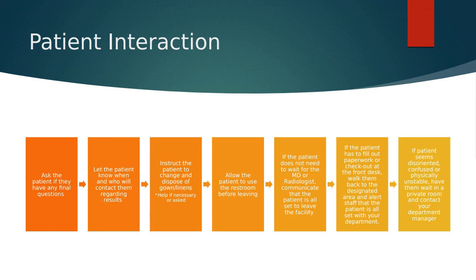So patient interaction when we are leaving, you want to make sure you ask the patient if they have any questions for you. They're usually always going to say, did you find anything? And you cannot say anything. So you will let them know who will contact them if you did or did not find anything, who will contact them with the report. Typically results go over to their doctor. So our doctor writes the report. It gets sent electronically to their doctor, typically within 24 to 48 hours. So you want to instruct your patient to communicate with their doctor regarding results of the exam.